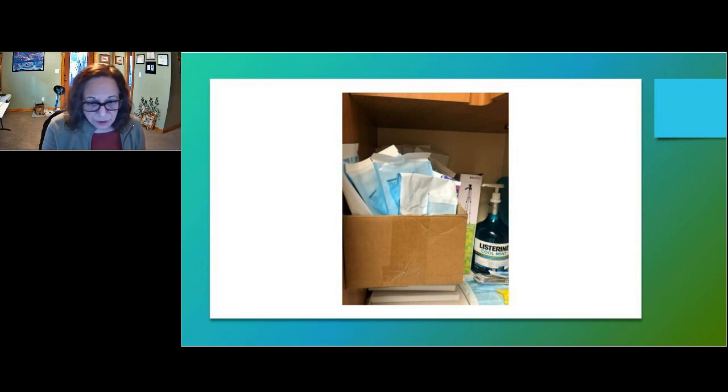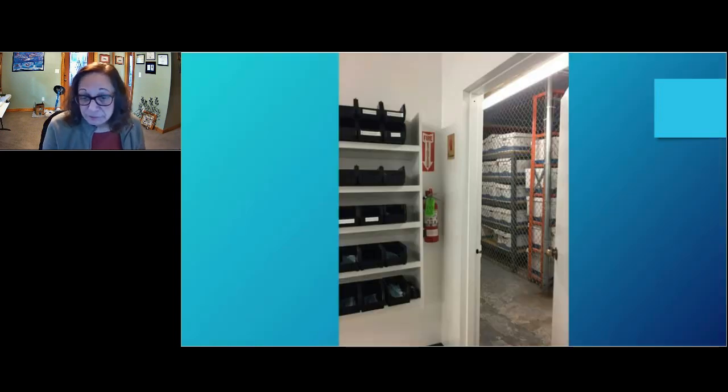And again, I wouldn't want to use that instrument, definitely wouldn't want to use it on a patient. Besides the fact that it's being stored in cardboard. If I don't say this once, I'll say it 100 times. No cardboard for storage, whether it's for partitions or bins, boxes, whatever, no cardboard, only washable surfaces.